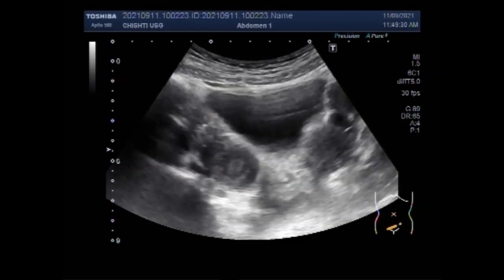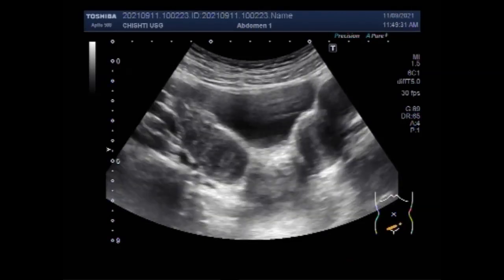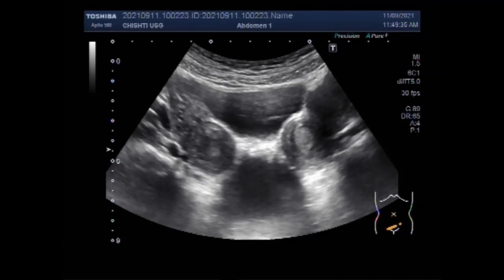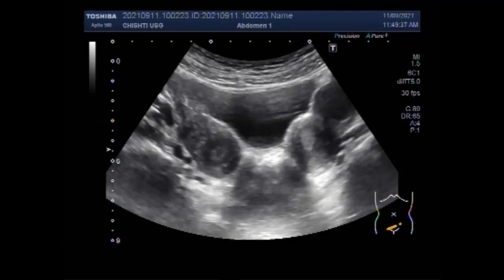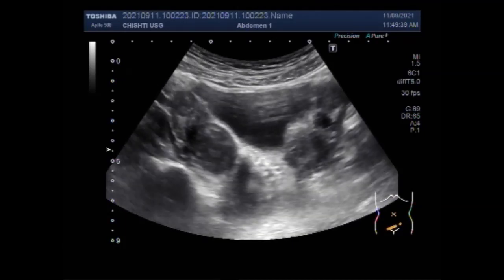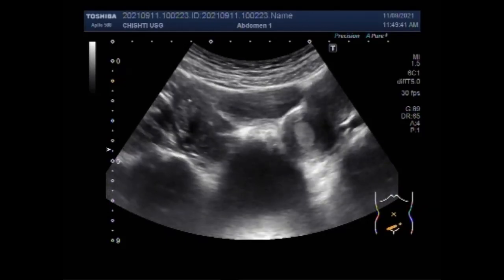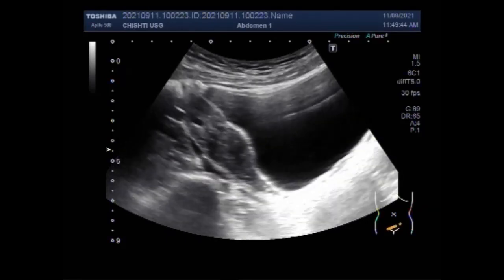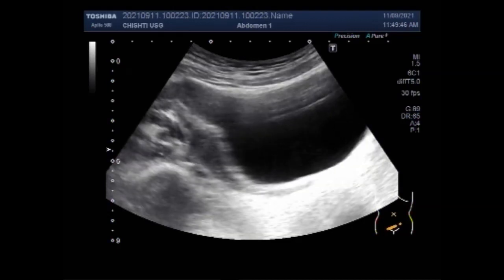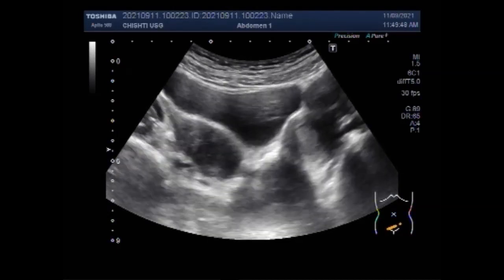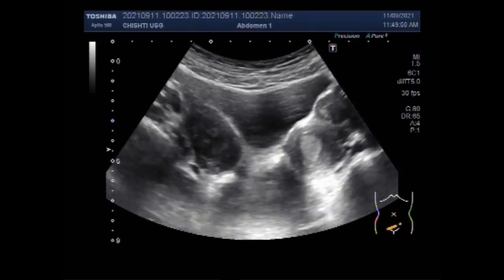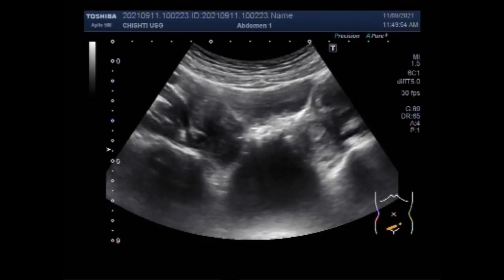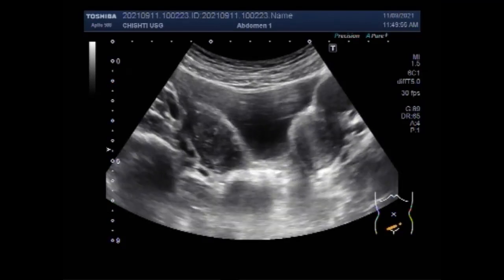Now you can see the uterus lying on the left side as well as the uterus lying on the right side. Both the ovaries are also visible, lying just adjacent to the uterus on their respective sides — right and left ovaries — and both ovaries show a cyst in their interior.